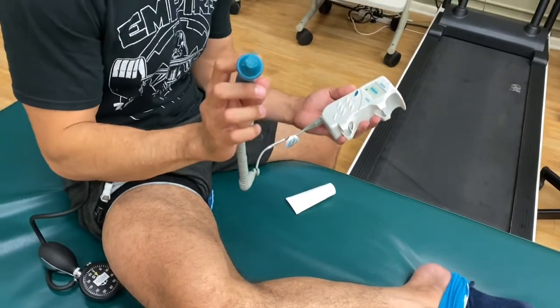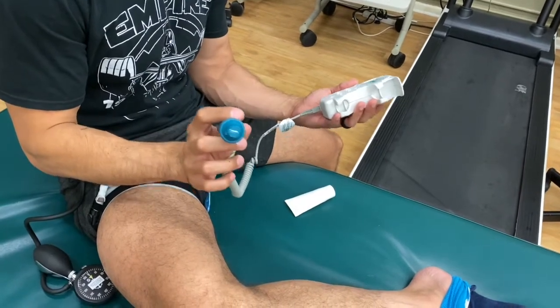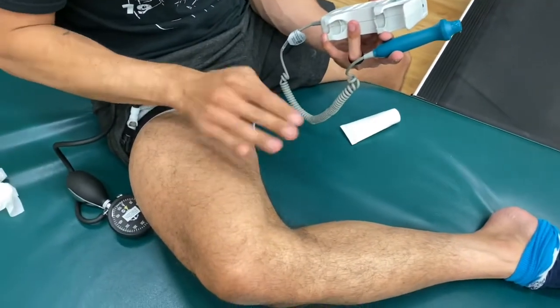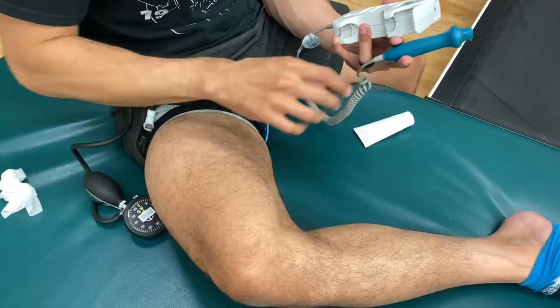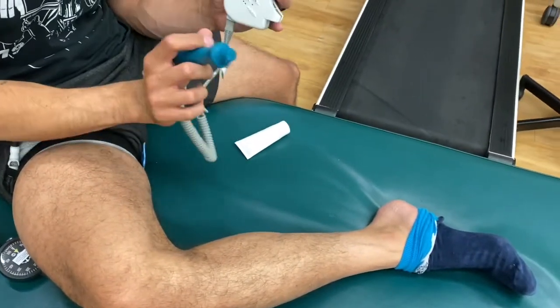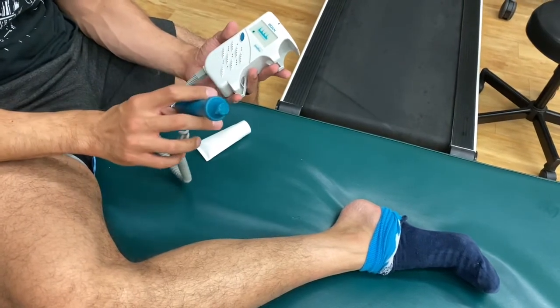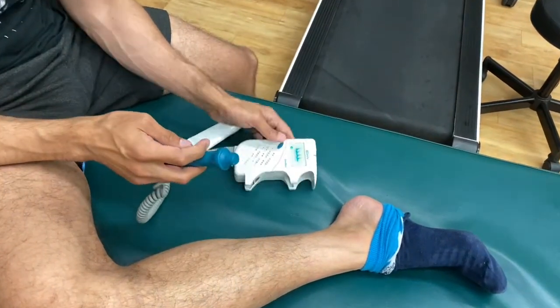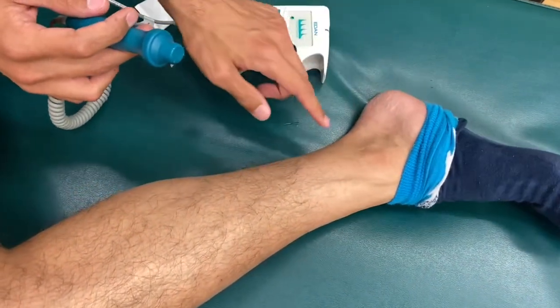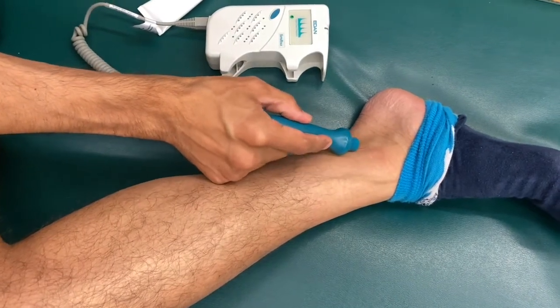The probe can go in a couple of different places. If you're using a proper ultrasound, it can go in the femoral artery, which is on the upper portion of your leg, on the inside. But if we're looking at the tibial artery, which has been validated for the ultrasound Doppler, and I think is a much more convenient place to look when using this technology, we're going to find the medial malleolus, which is the bony protrusion of our foot right here. And then we're going to go directly posterior and then superior, so a little bit behind and above.